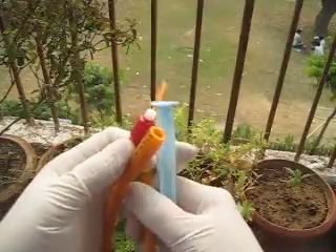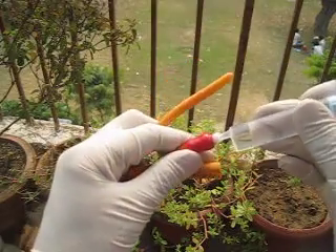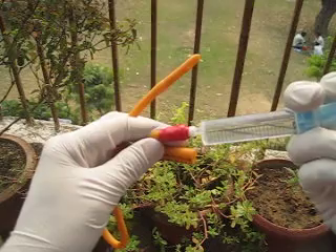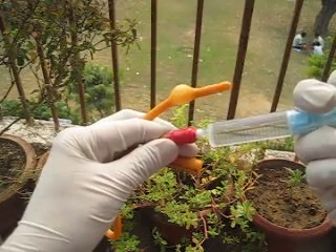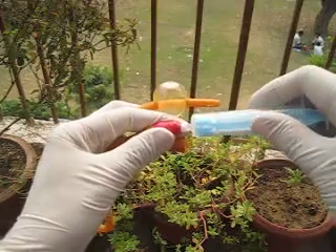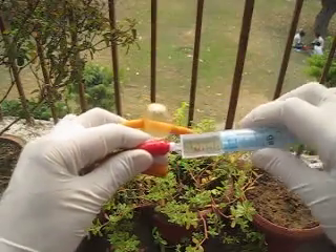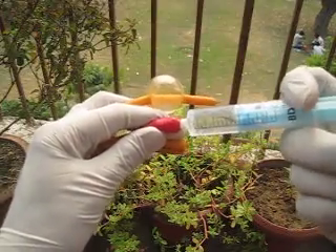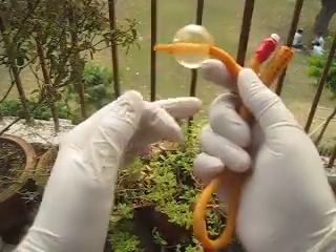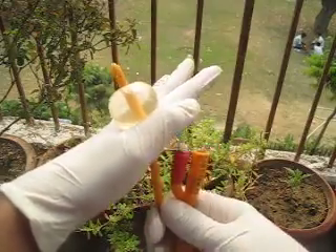If you want to inflate the balloon inside, you can see how the catheter looks after inflating it. You have to insert normal saline here, and you can see the balloon will get inflated. In adult males, we inject about 20 ml of normal saline, and in children you can use about 2 ml.